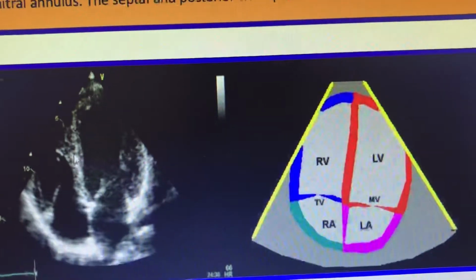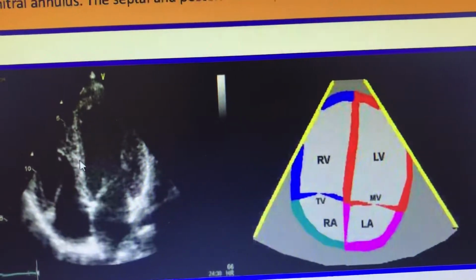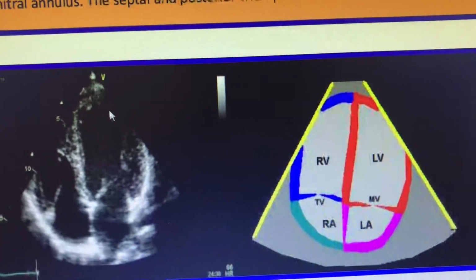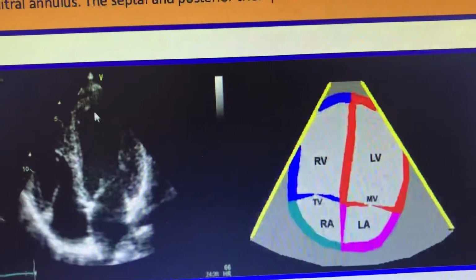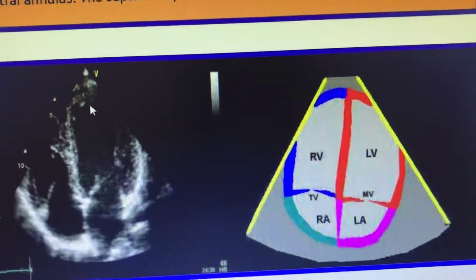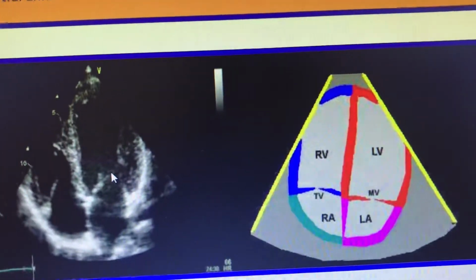If there is severe LVH but no other markers, but there are speckled appearances with huge enhancement, then most probably you are dealing with amyloidosis. You can be dealing with apical HCM if the apex is very much thickened. You can see apical hypokinesia, septal hypokinesia, lateral wall hypokinesia. All these regional wall abnormalities will be seen in this view. Apical clot, thrombus, all those can be seen very well in the apical 4-chamber view.